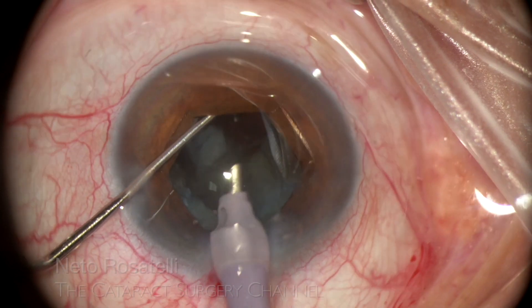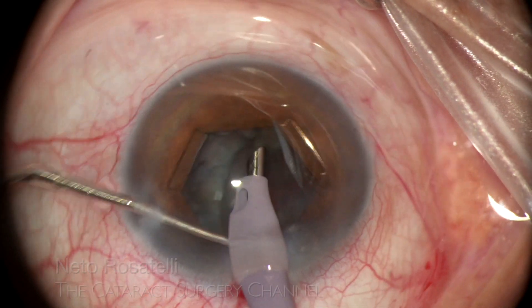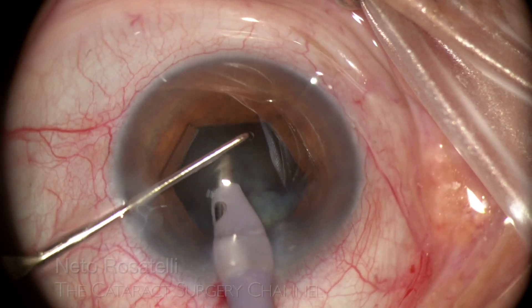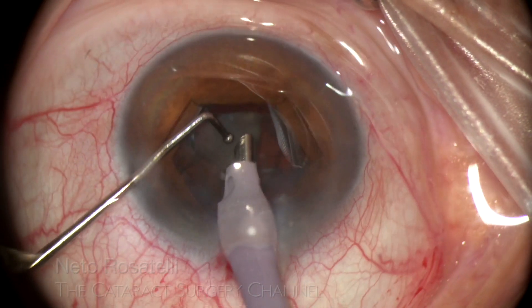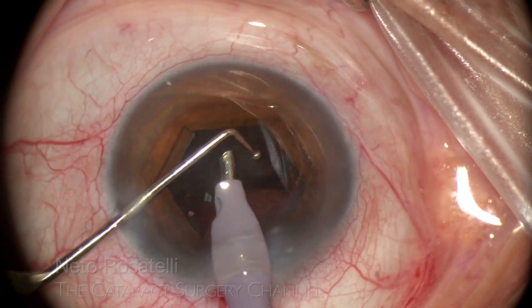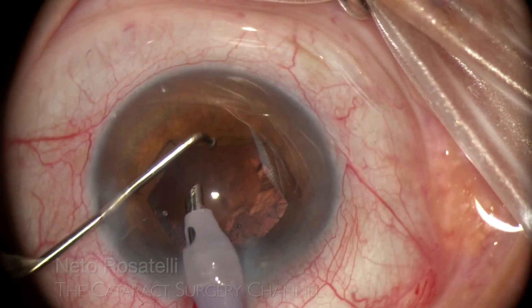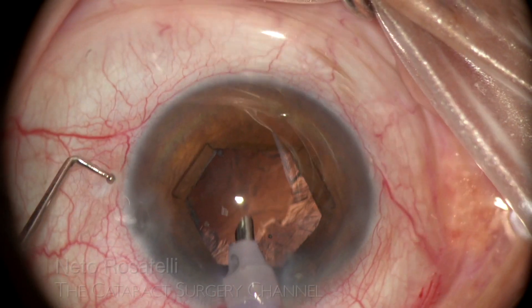Staying in the center of the pupil — the safe zone — is important, and the chopper helps in many ways: rotating the nucleus pieces, bringing them to the phaco tip, chopping fragments, and performing protective maneuvers such as protecting the pupil margin, the posterior capsule, and also preventing pieces from bumping into the corneal endothelium. Inspection is done to ensure there are no hidden remaining nucleus pieces, and cortex removal is next.